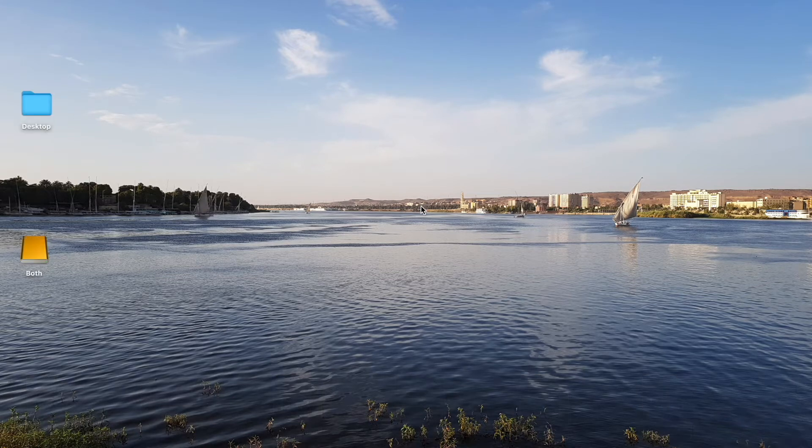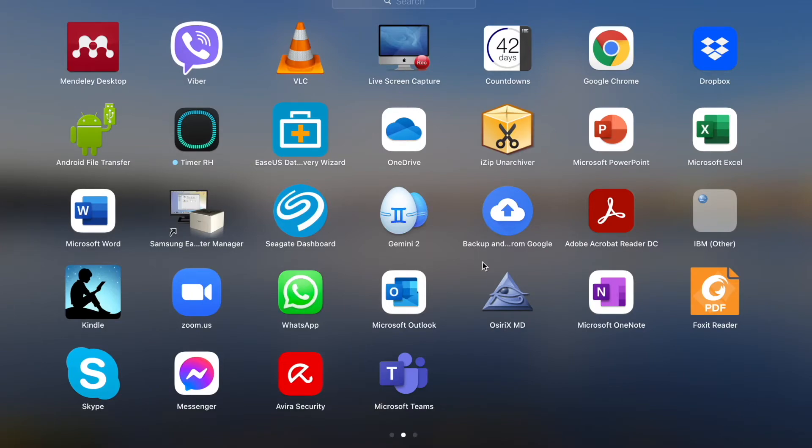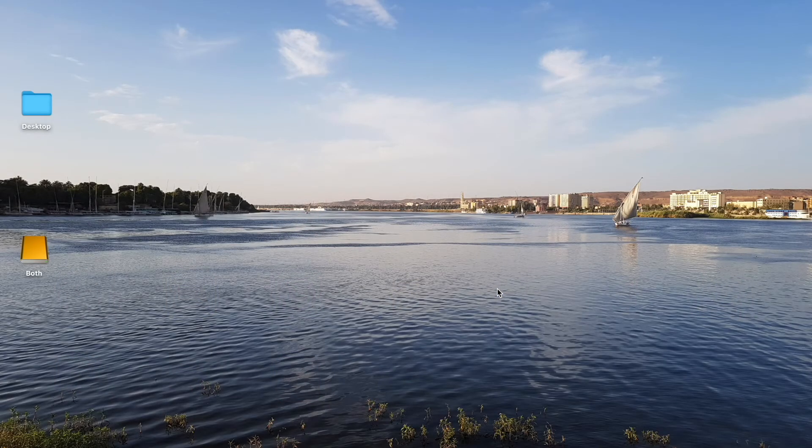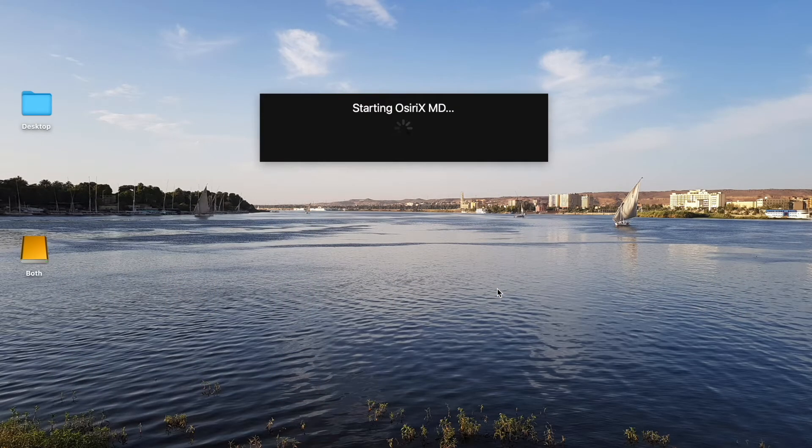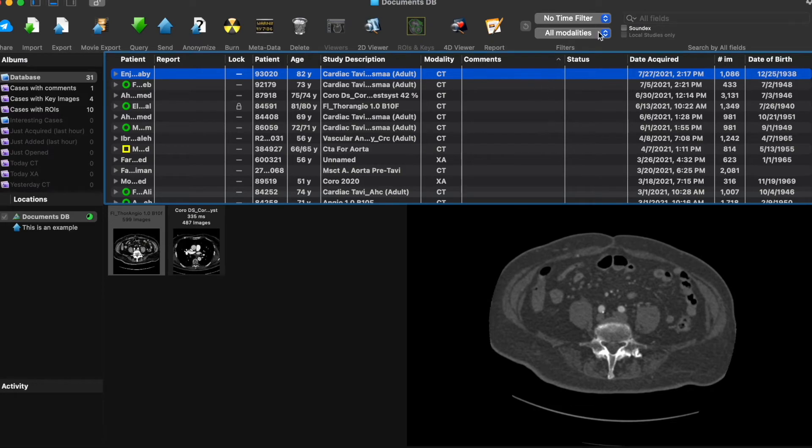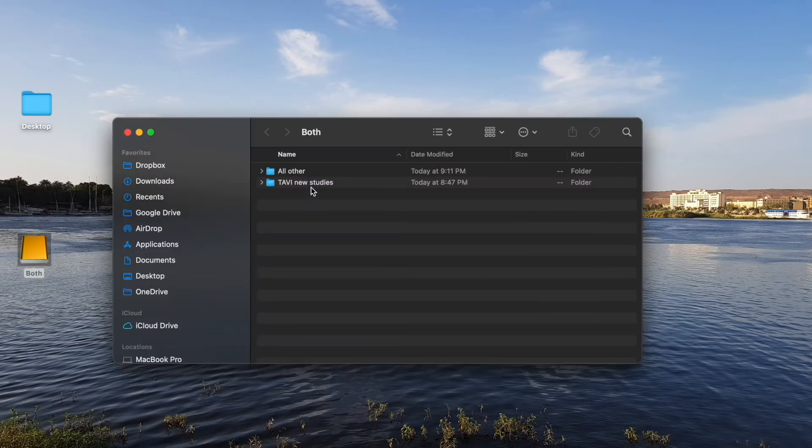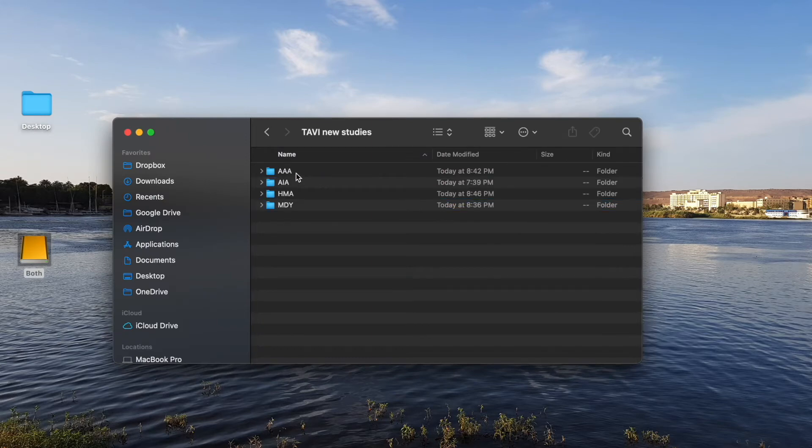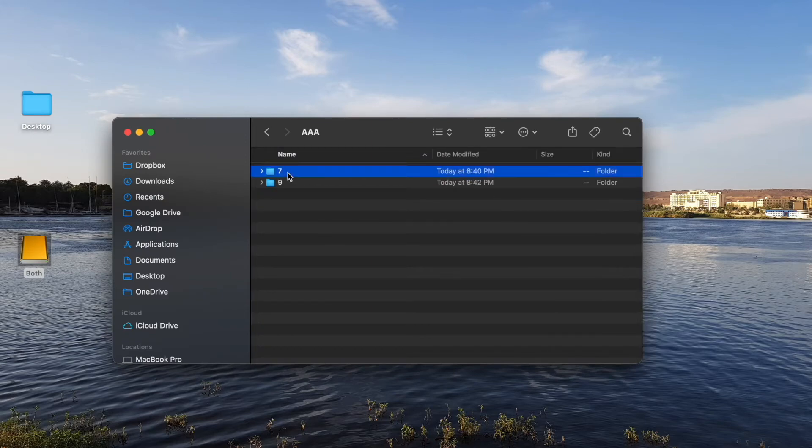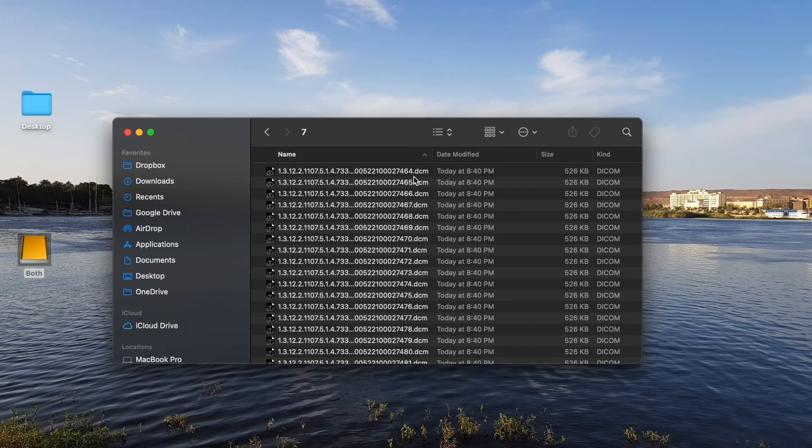First of all, we open the software, as you can see here. And then you have so many options how to add your DICOM files. First one, and the easiest one, is that you drag and drop, and we minimize this first. And then we click where you are having all your studies. And you have to make sure that the studies are recorded into DICOM files like this. So the extension is going to be .dcm.